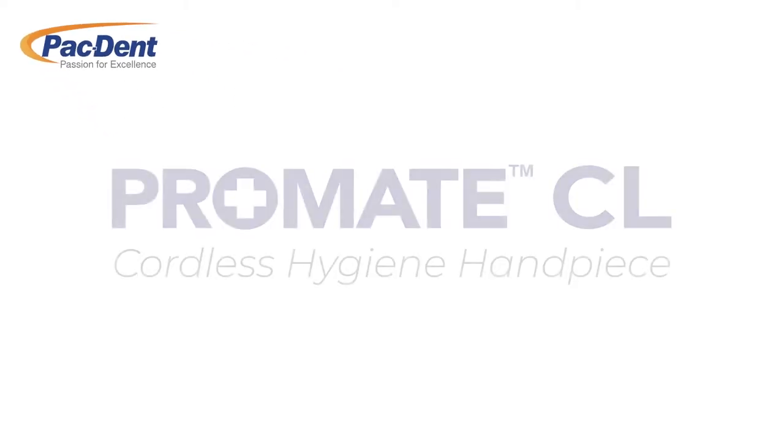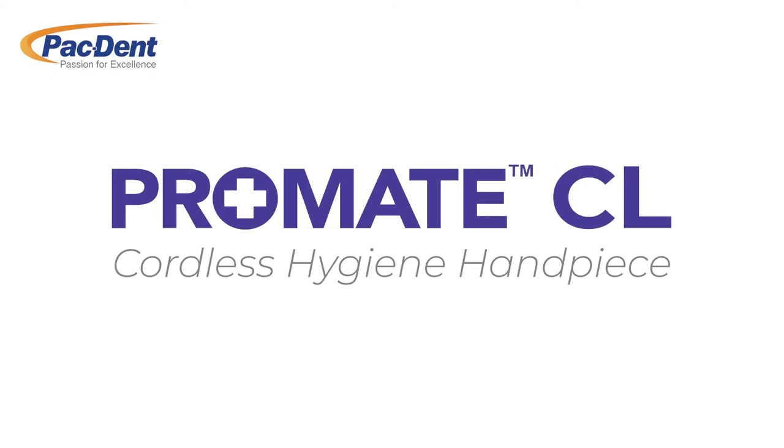Pac-Dent is excited to announce the ProMate CL, our new cordless hygiene handpiece.